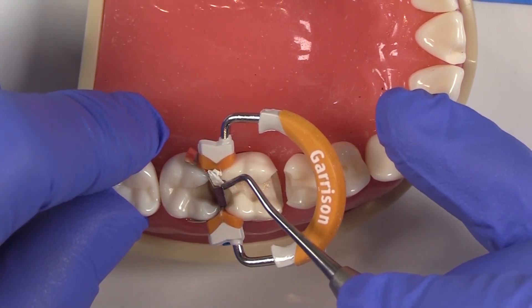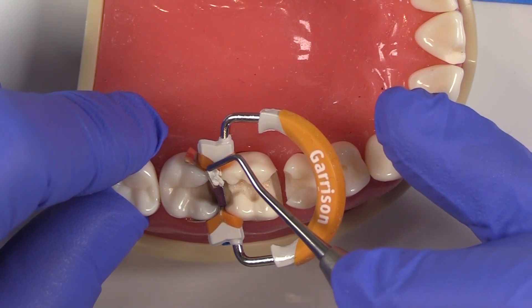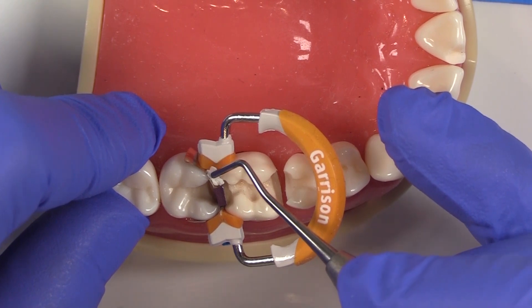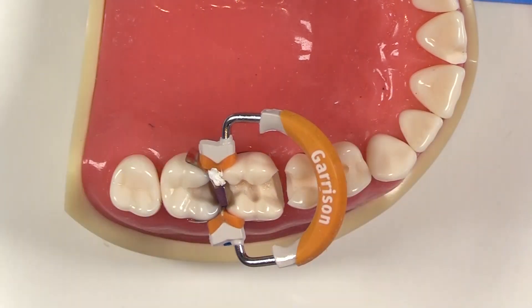An important step here is not to overdo it either — you're not trying to create a crease. My only goal here is to minimize the flash of material on this proximal wall right here, and that way I'll save a lot of time on finishing that area.